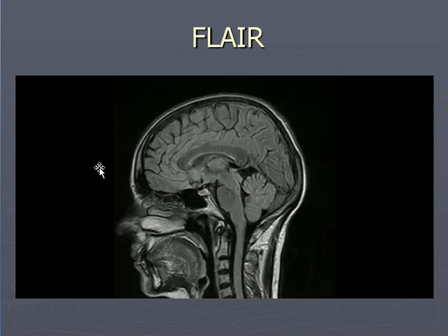Now this is FLAIR. Here you can see it's not very much different from the T1 weighted image. The CSF is still black, but it is usually performed to see the encephalomalacia or other conditions in the brain, to differentiate it from the CSF space, filled spaces, or real myelomalacic changes.